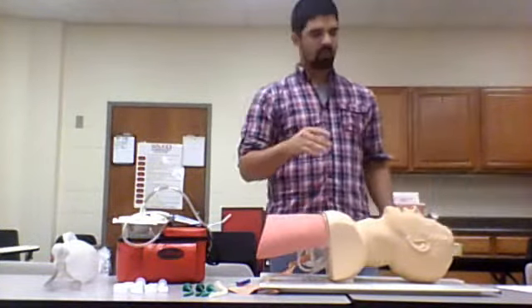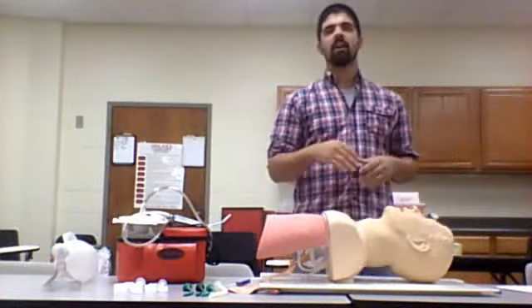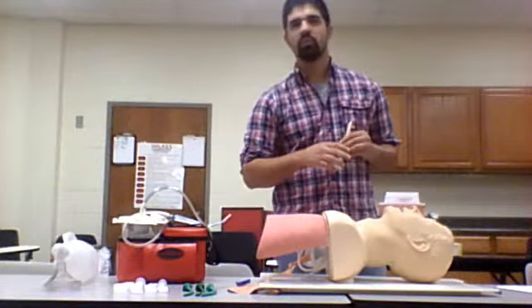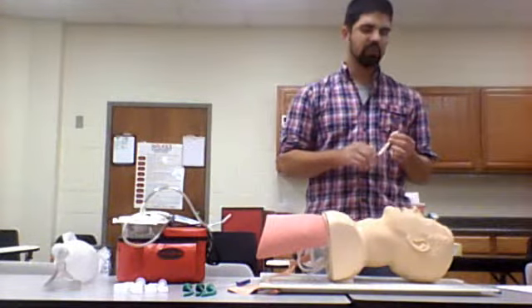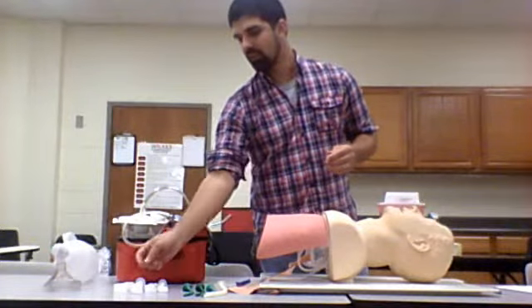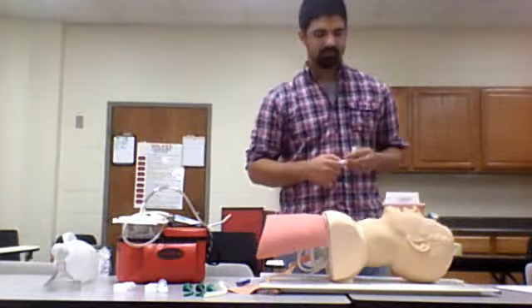So first things first, we've done our assessment. Is this person responsive or unresponsive? Look, listen, and feel. And what we're going to find in this particular patient is that they are unresponsive and they are apneic. They do have a pulse, but they're unresponsive and apneic. Okay, in a truly unresponsive patient, you wouldn't think they would have a gag reflex, so we would try an OPA. But first we need to open the airway.